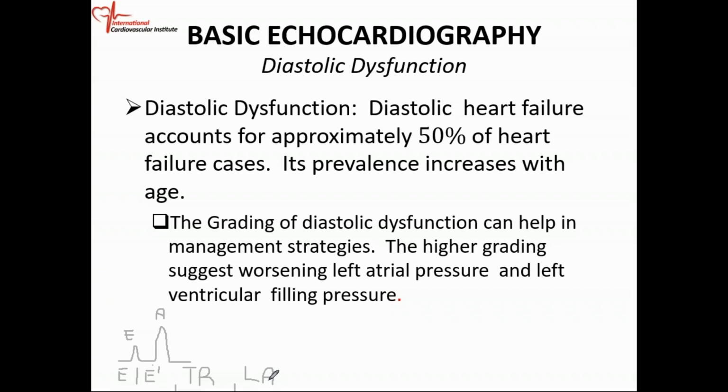Abnormal relaxation, grade 1 diastolic dysfunction. We're going to move on to grade 3 because it's easier to understand grade 3 than grade 2, and then we'll go back to grade 2. So if the patient has grade 3 diastolic dysfunction, these patients are very easy to recognize.